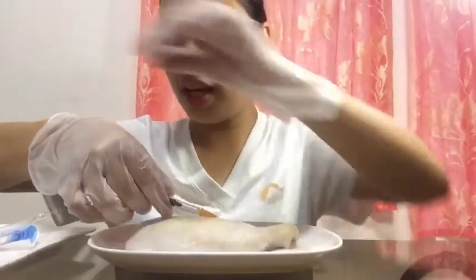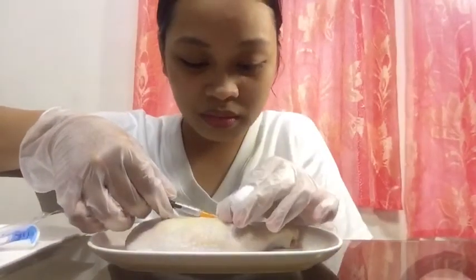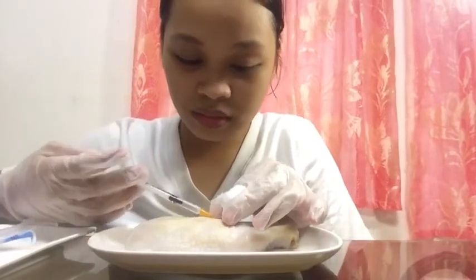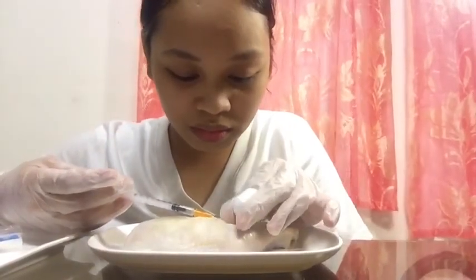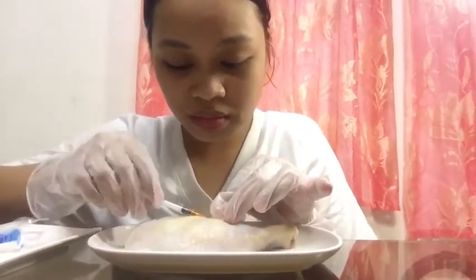I'm going to use a cotton ball. Then I'm going to discard my needle. And then I'm going to remove my gloves.